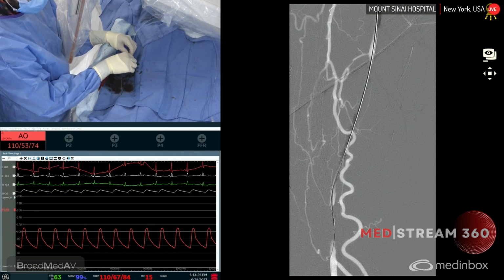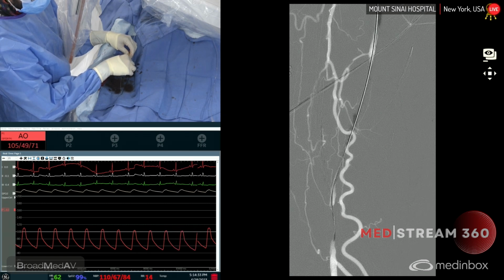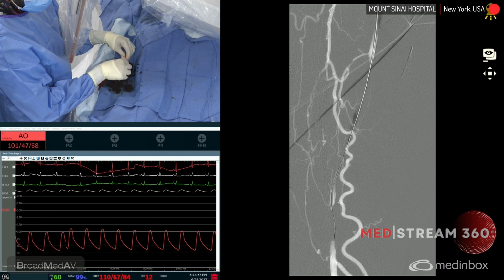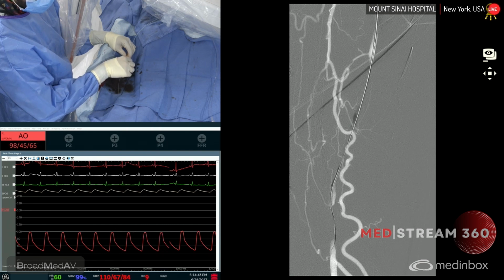Some of these short occlusions can be tricky in the sense that this seems to be maybe sliding on top of the vessel. So in this kind of situation, let's see how it goes. You don't want to extend the dissection plane too far down and too far past this. Does it feel real or no? It feels pretty good, right? Or no, yeah, it's not behaving.